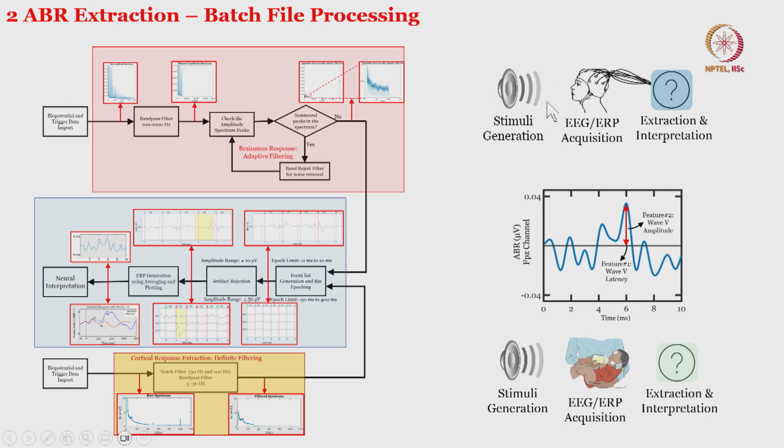A sound will be presented to a subject, the data will be recorded, extracted and interpreted. So it will look like this. As I mentioned, it is of a few tenths of a microvolt. Here it is like a 0.04 microvolt peak, and it is getting generated in 10 milliseconds.